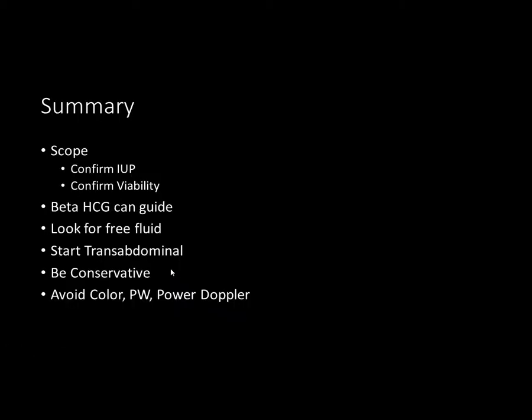In summary, it is important to keep in mind your scope of practice and your current practice environment when performing an obstetrical ultrasound. In general, bedside ultrasound is used to confirm IUP and confirm viability. Occasionally, in offices such as MFM, maternal fetal medicine, and some obstetrical offices, anatomy scans will be done. However, this is not typical of most focused bedside ultrasound.